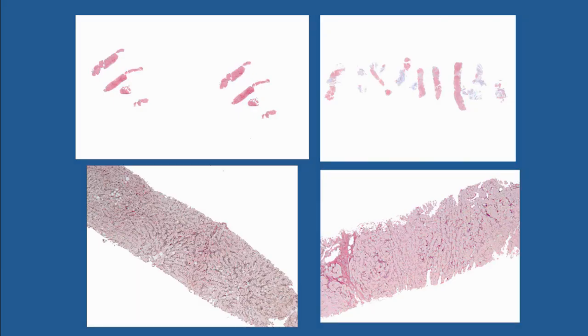And finally, the reticulin stain is very useful to show whether fragmentation of a liver biopsy is due to the procedure or due to advanced fibrosis. So here we have 2 fragmented liver biopsies, and you can actually see some increased fibrous tissue over here, and it looks like this fragmentation might be due to increased fibrosis. However, on this side, you do not see the fibrous tissue, but you're not sure if this is due to advanced fibrosis or just the procedure.